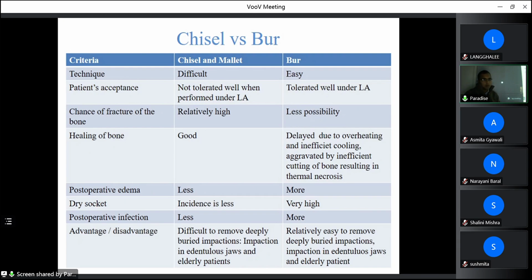And whenever we are dealing with an HIV positive patient or a hepatitis B positive patient, or during the COVID times, we don't use the aerotor or micromotor straight handpiece because that produces lots of aerosol. Another reason is we can't put our straight handpiece or micromotor in the autoclave, so we can't sterilize the instrument.